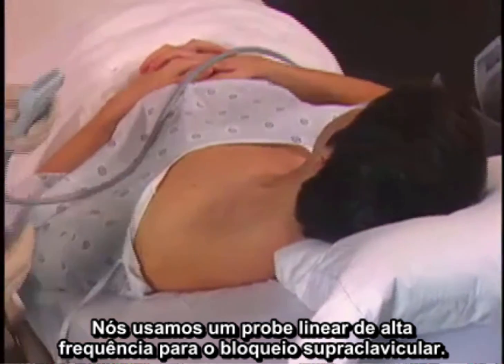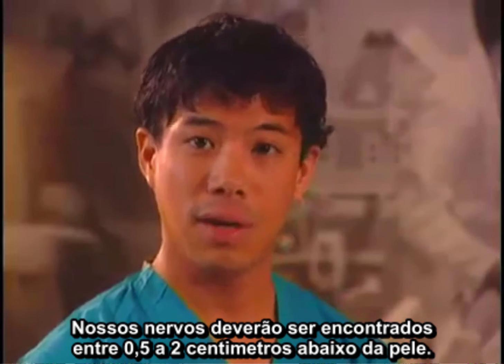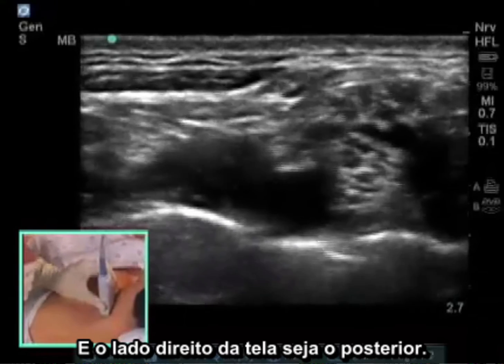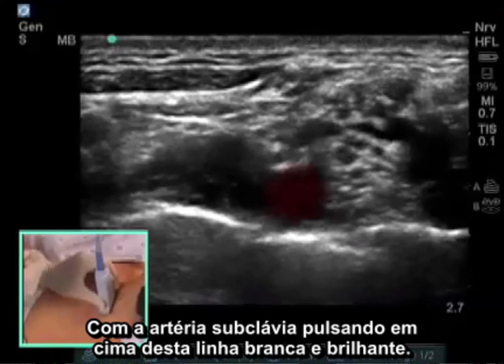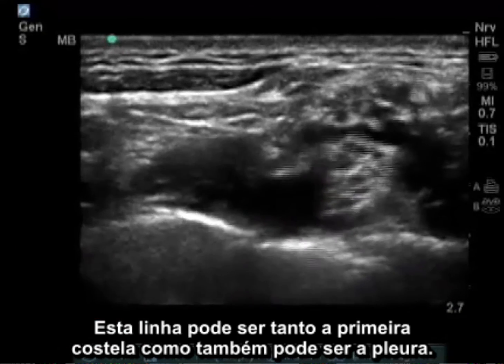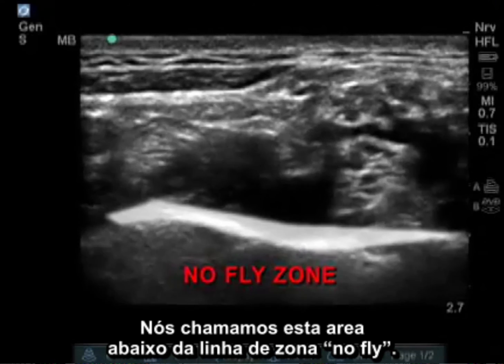We use a high frequency linear probe for the supraclavicular block. Our nerves should be found a half a centimeter to two centimeters below the skin. I have oriented the probe so the left side of the screen is anterior and the right side is posterior. We see a bright white stripe going across the screen with a pulsating subclavian artery sitting on it. This stripe can be either the first rib or pleura. Your needle tip should never be below this stripe — we call the area below it the no-fly zone.